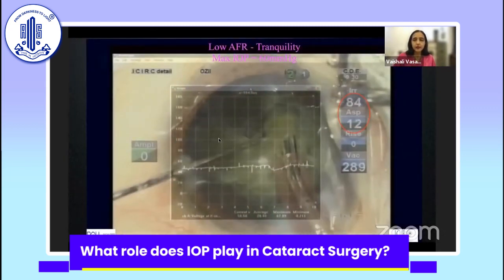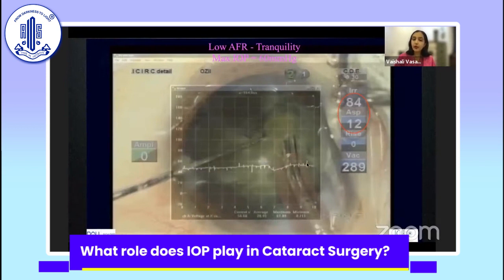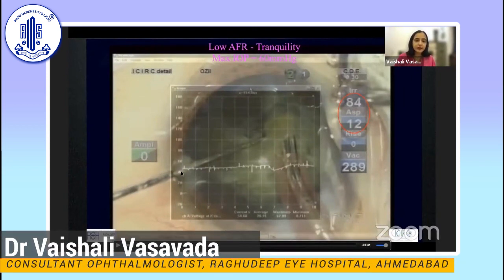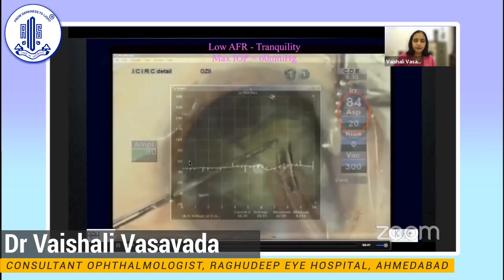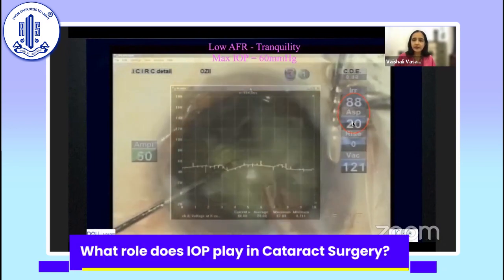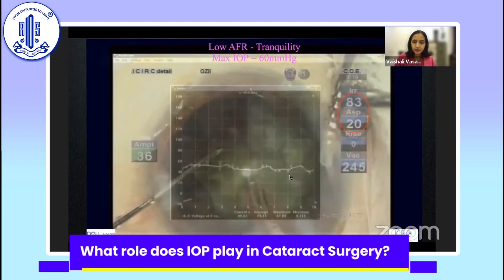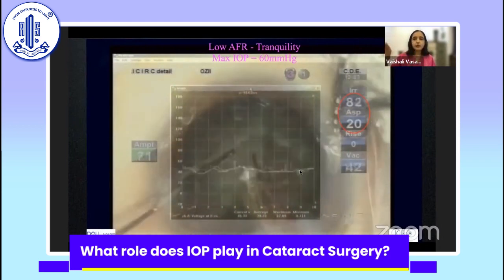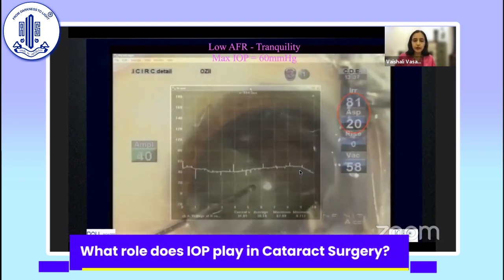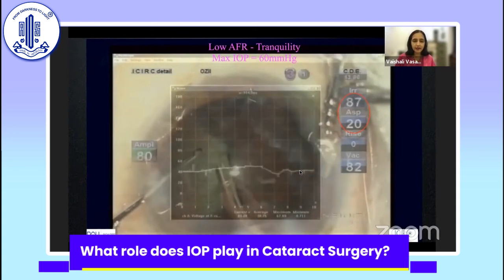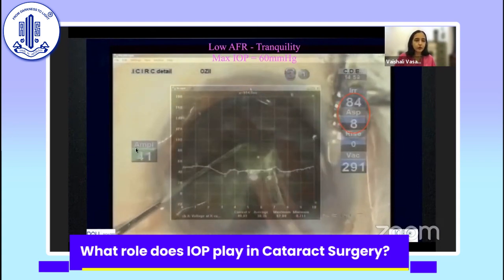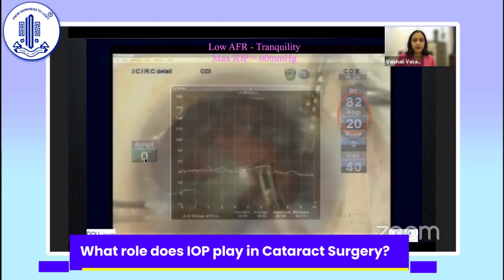In this video, the irrigation pressure is 84, corresponding to a bottle height of about 70–75 cm, with a flow rate of 20 cc/min. A fragment is being removed, and the white trace shows intraocular pressure — 40 mmHg at the lower mark and 60 mmHg at the upper. With 20 cc/min flow and 75 cm bottle height, pressure remains between 40–45 mmHg on average, with a very smooth trace and no clinical surges. Torsional ultrasound is used continuously at about 70% preset.